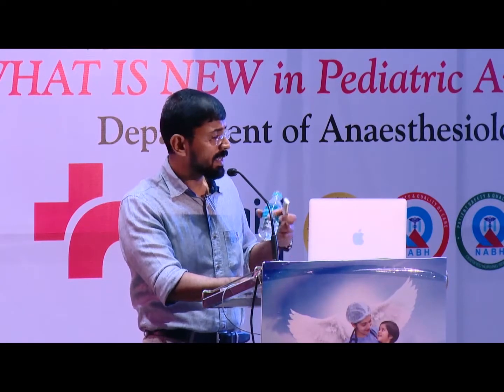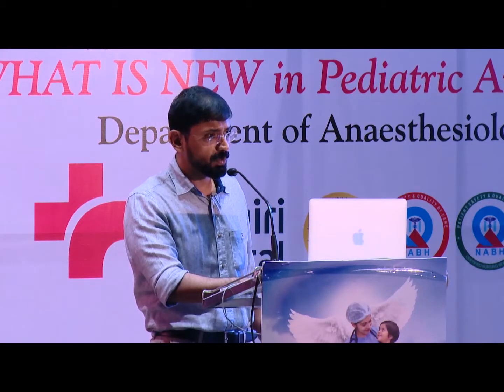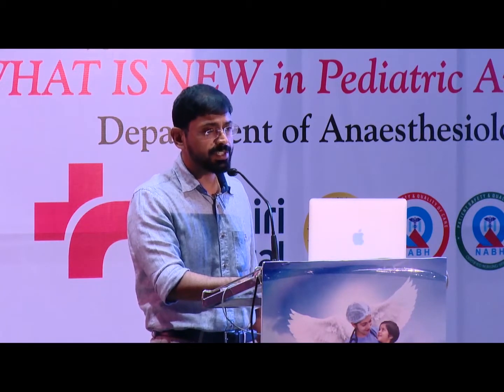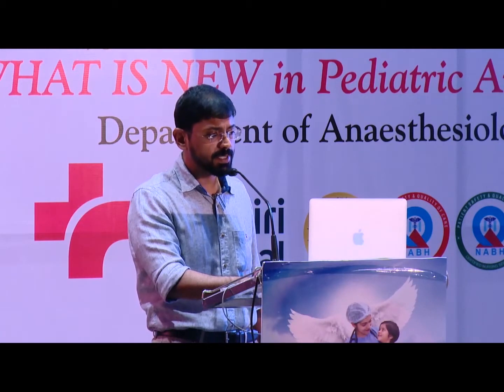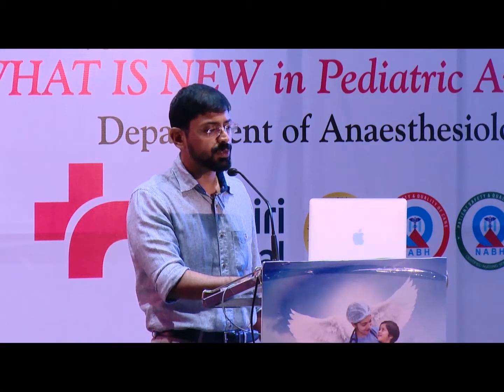Now this is where I will make it a cat and mouse game. I just present a slightly alternate scenario where, after starting him on HFOV, rather than an improvement, a repeat gas actually shows that he has worsened. The pH is 7.08 and the PCO2 is 82.